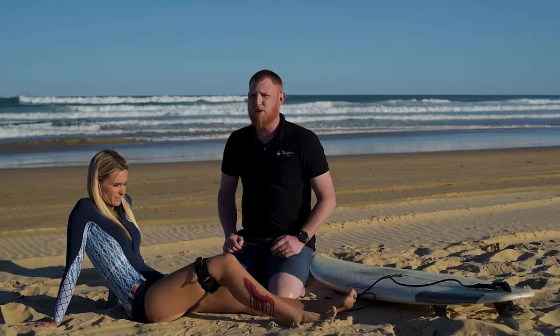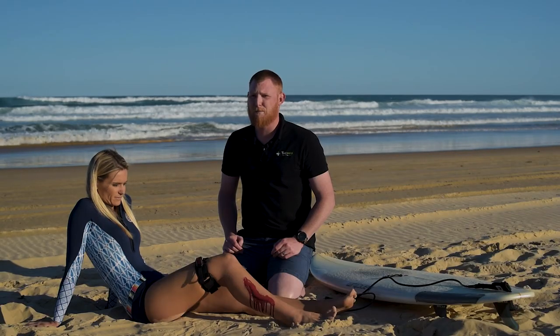It's as simple as that. Quick, effective and most importantly life-saving. The Omni-Tourniquet board leash.